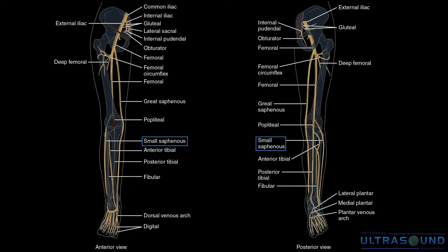Now, believe it or not, this system only accounts for about 5 to 10% of the blood flow back to the heart. And what is the superficial system? Well, we have two veins in particular that we look at. One is the small saphenous vein that originates at the ankle and the posterior calf and has multiple confluences. And why I say that for you as the investigator, as a sonographer who could be working with the interventionalists that do thrombectomy work, you want to make sure you let them know where the small saphenous vein confluences into, because sometimes it doesn't always confluence into the popliteal vein. It confluences into the gastrocnemius vein, or it extends up the back of the leg.